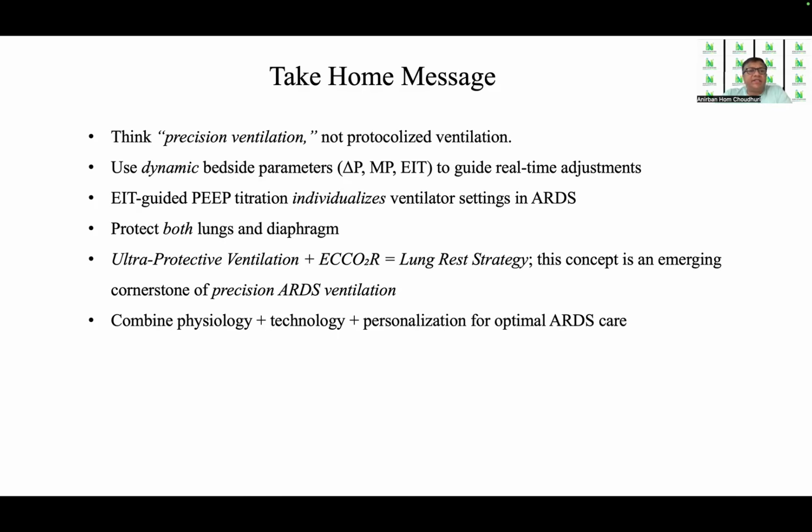So my take-home message is that for ARDS, we have to think now of precision ventilation and not protocolized ventilation. We use dynamic bedside parameters, the driving pressure, the mechanical power, and electrical impedance tomography to guide real-time adjustments. EIT-guided PEEP titration individualizes the ventilator settings in ARDS and protects.